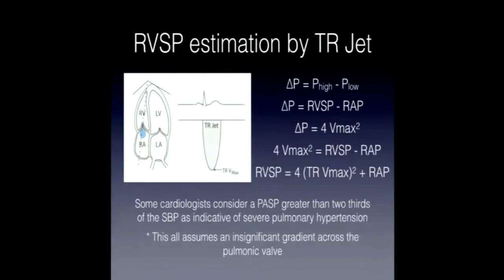Oh, that's good to know, and that's where it comes in, the RAP factor there. And if they have a right heart cath, then things are a lot more accurate.